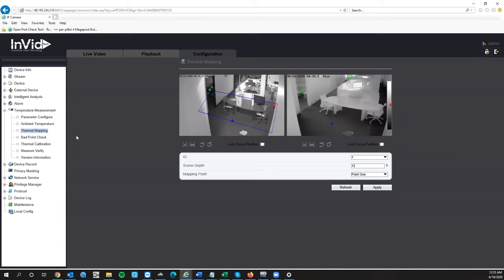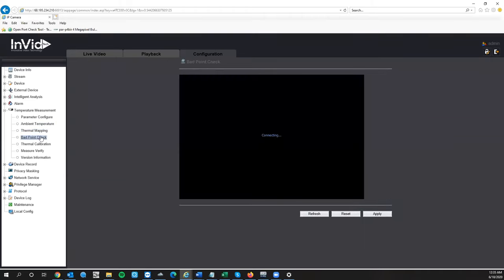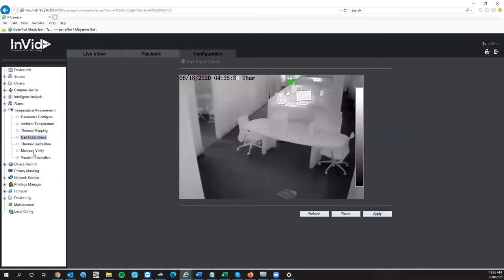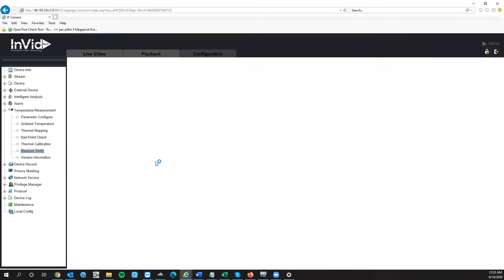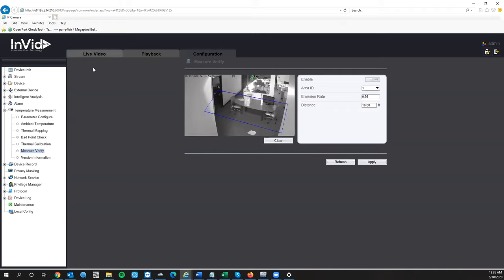That is the setup process of the camera. Ambient temperature — don't adjust those settings. Dead Point Check is a tech support tool — you won't need that. Measure Verify — don't turn that on; it's another tech support tool that turns off face detection.